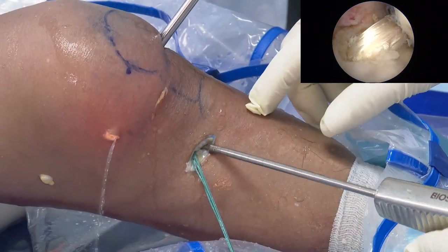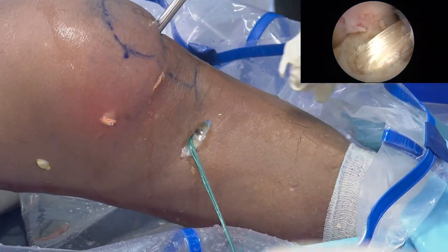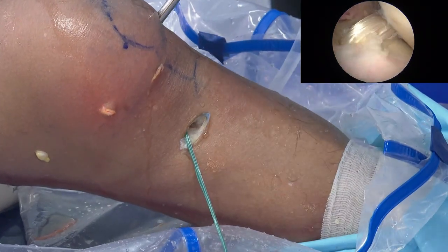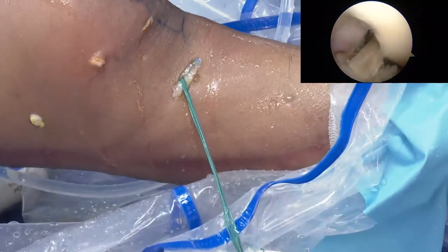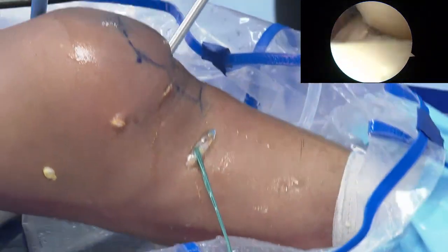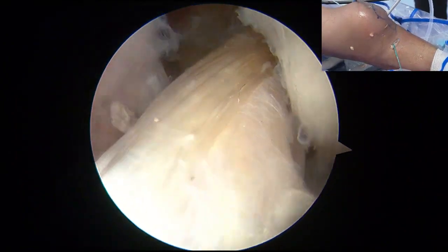Okay. Good. Connect. Very good. So very nice construction. See, and you see that the orientation is nice, and also you have no impingement, right? 移植物的方向非常好，没有发生撞击。Okay. So that's the benefits of the ultra button, right?